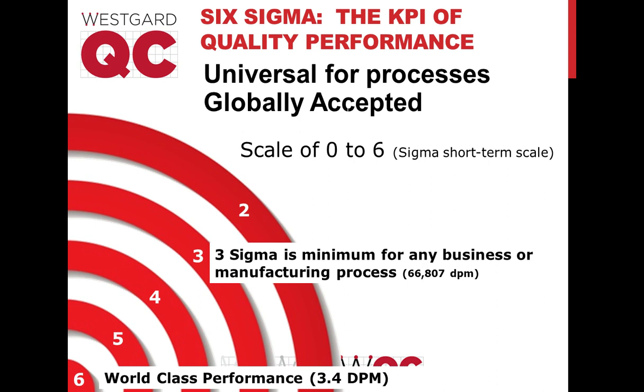But if we were going to be using a control to determine our bias, so for instance, we have a control and we have the peer group mean or the labeled mean, if I was going to be using that to determine my bias, I would also want to use the imprecision from that control in any assessment of sigma metric. I wouldn't want to use the imprecision of the manufacturer control and then the bias of a third-party control to come up with a sigma metric.